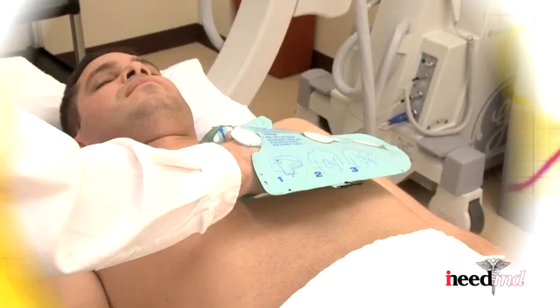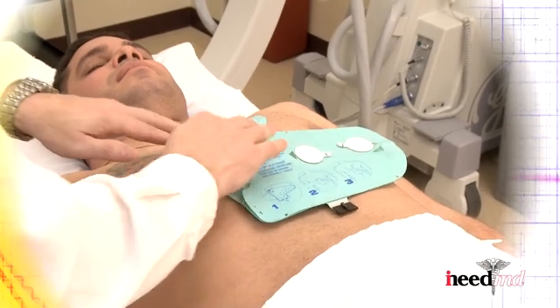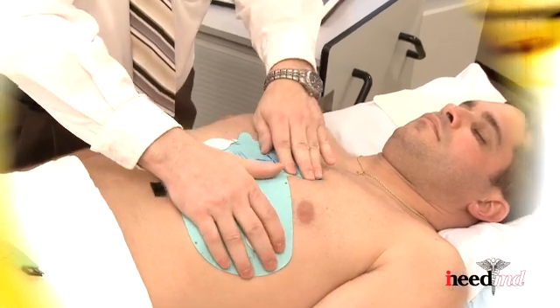After the glove is placed properly to the chest, press the electrodes firmly. Remove your right hand from the glove. Placing both hands over the glove, press down on the glove, both on the right and left side.